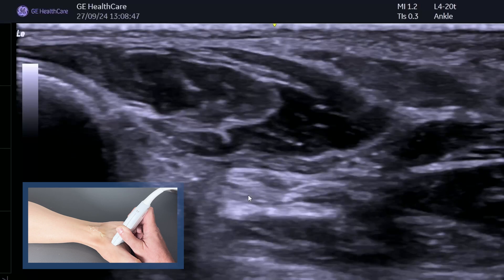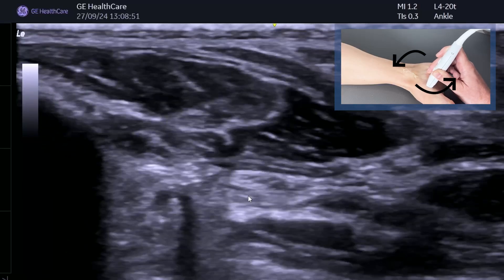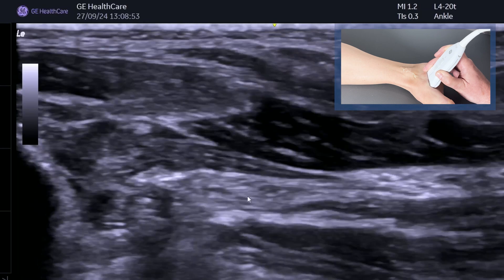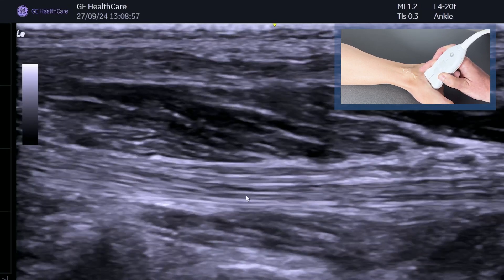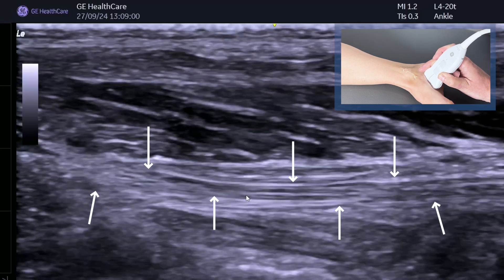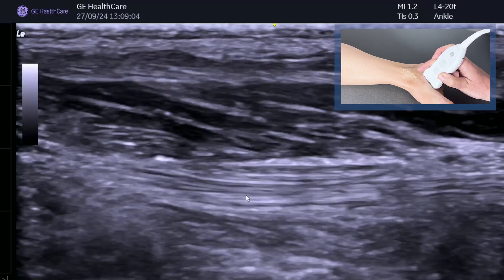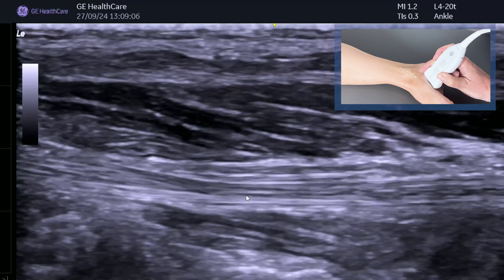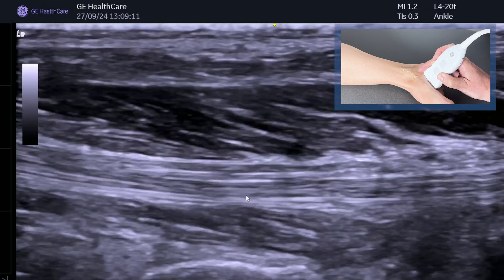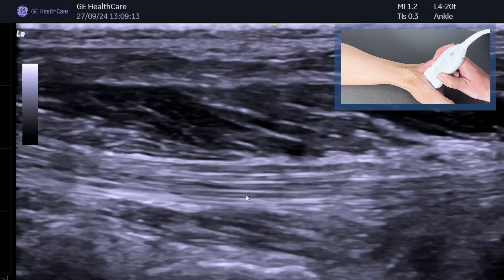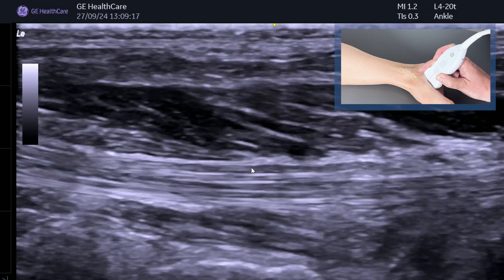We can also get a nice image of this in long section — so if we spin here. This is a really nice picture. Just to orientate yourself, FHL is the one moving underneath. I'd always recommend that you as the operator move the toe rather than asking the patient to do it, because everything moves in one go. This is FHL running all the way from the left to the right, and on top of it is FDL where it overlaps.